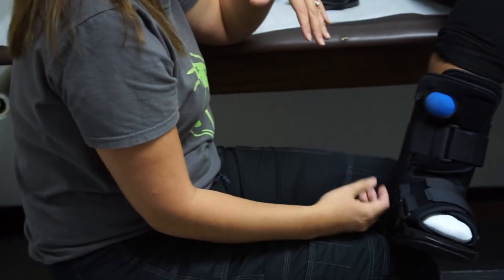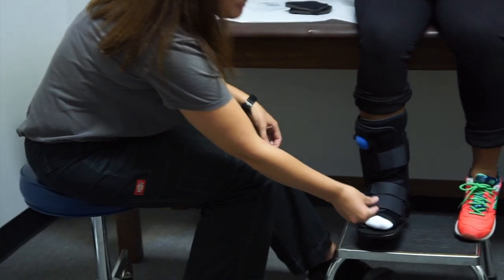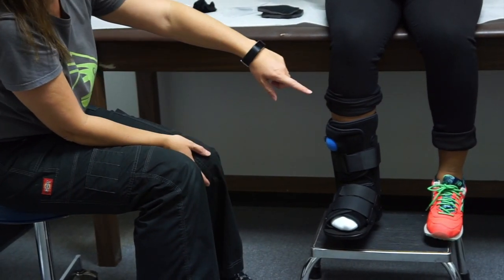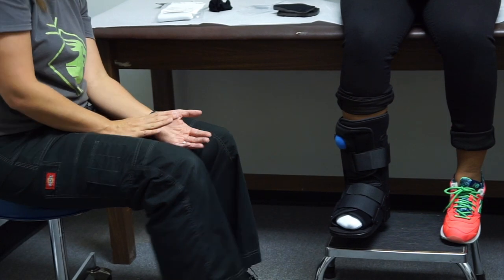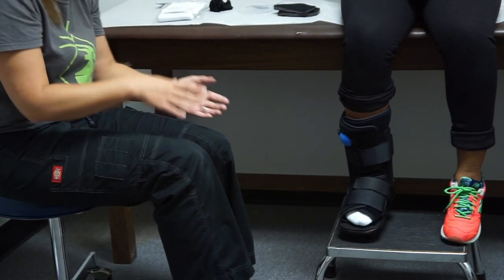There we go — that's our short boot. It has a high sole, so make sure the patient is wearing a flat, comfortable shoe on the opposite foot. Because it has a rocker bottom, it is made to walk heel to toe — so when the patient walks, instead of swinging their foot around to the side, they walk heel to toe.